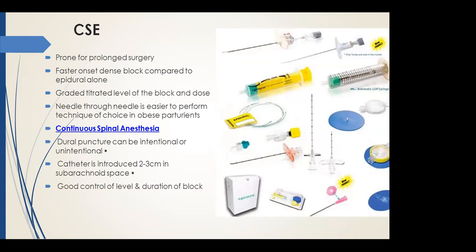It has a fast and immediate onset, and the sympathetic blockade is limited and controlled due to the graded, titrated epidural block. The needle-through-needle technique is easier to perform in obese parturients. And the time taken for CSE as opposed to spinal is not increased. We can definitely perform CSE even in emergency situations.